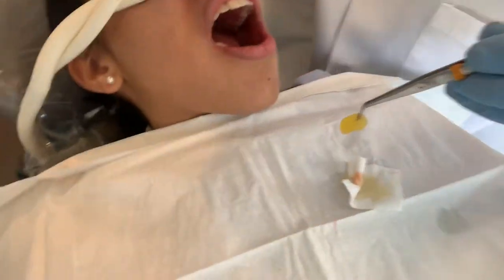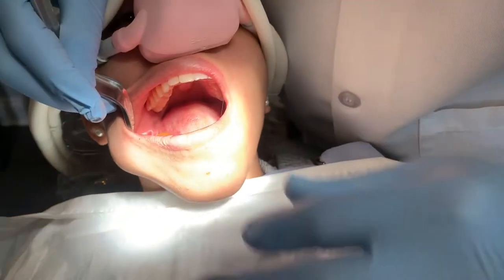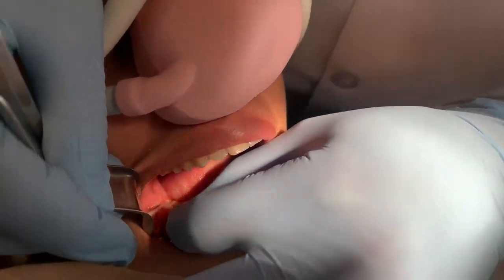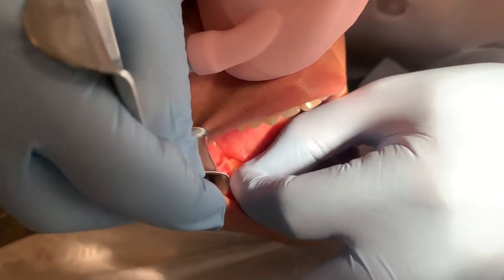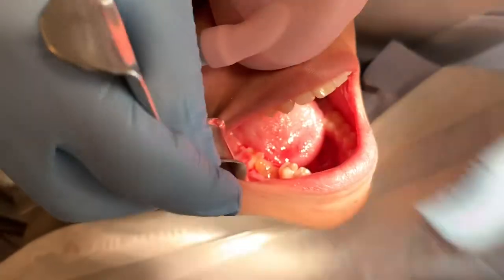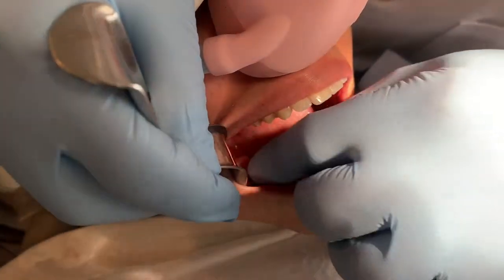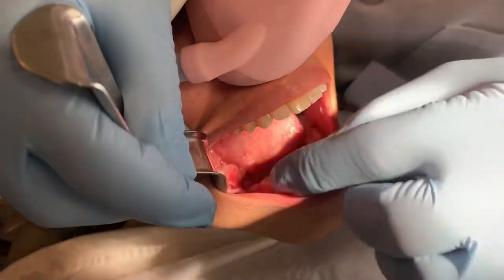I'm going to come over here to our extraction site. We're going to put the platelet-rich fibrin in here. It looks very substantial. It's going to seem like it really isn't going to want to go in there, but I've trained my fingers to really get it going in the right direction. And then when you get it near in there, you can start pushing it with a little bit of cotton. You'd be surprised how much this stuff will fit in here.